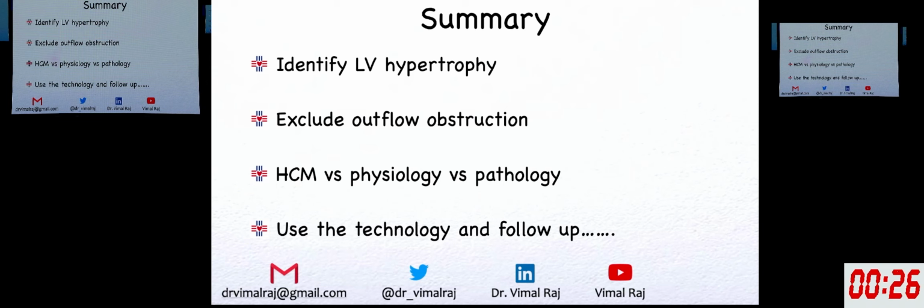Okay, and if we do 100 cases of suspected HCM, about 55 to 60 are HCM, about 20 to 30 are non-HCM, and about 10 we do not know. Okay, and please, I'm very honest when I say I do not know. I say this is not typical HCM. You need to do something more.